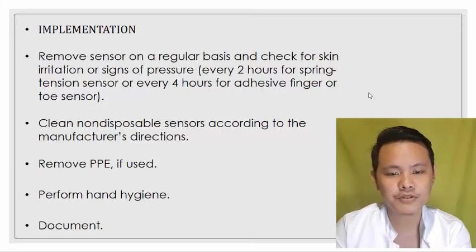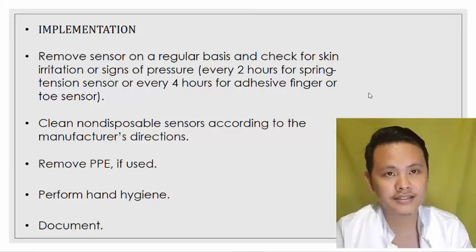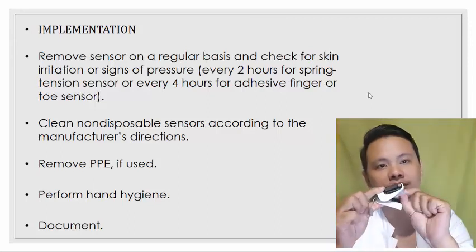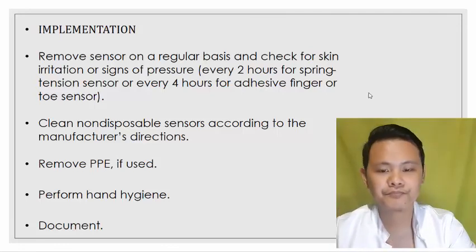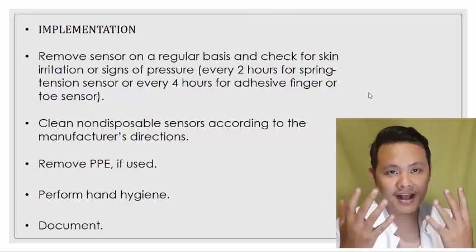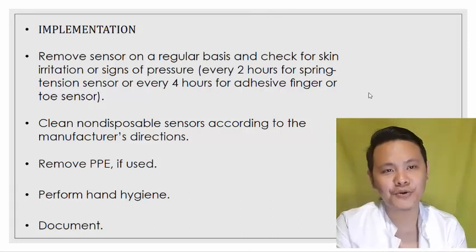Next, clean the non-disposable sensor according to the manufacturer's direction. Or yung tinuro ko sa inyo guys, okay, kapag tapos gamitin na to, wipe nyo sa may baba, and then wipe sa may taas. Okay? Then remove the PPE kung gumamit ka, and perform hand hygiene. Then last will be the documentation. Document kung ano man yung mga ginawa mo.